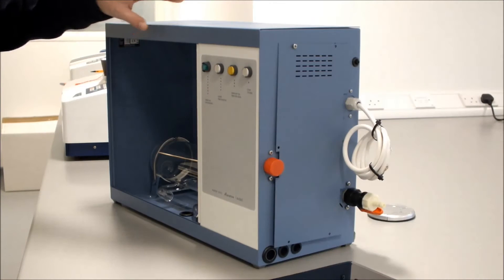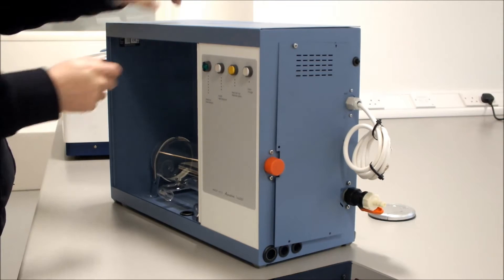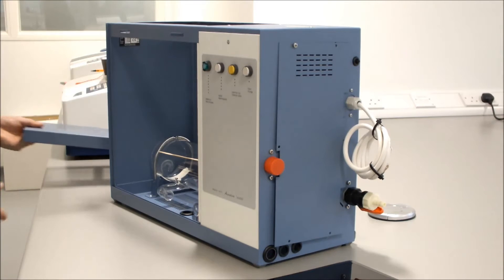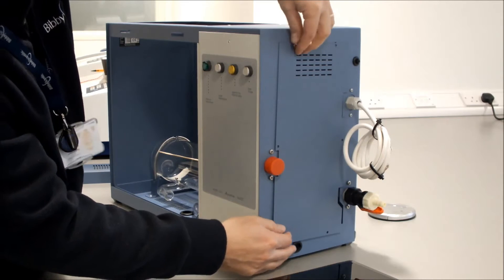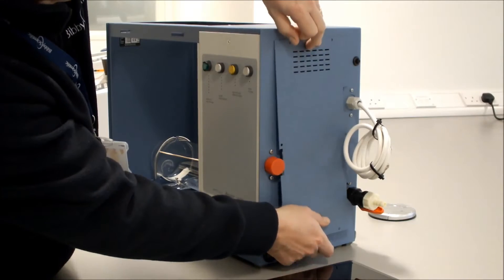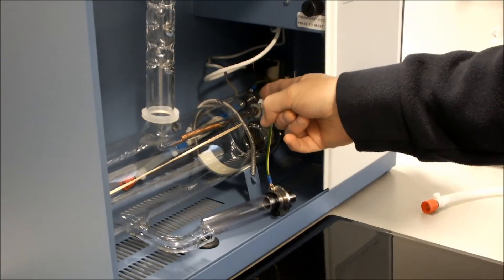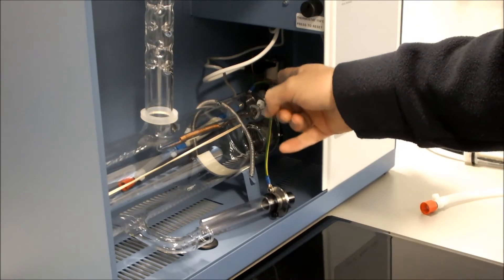The next thing to do is to remove the lid which consists of six countersunk screws. When they are removed the lid just is removed. And there are six screws for the side panel. Again these are removed and the side panel can be removed. We have also got the thermostat glass tube which runs inside the boiler.